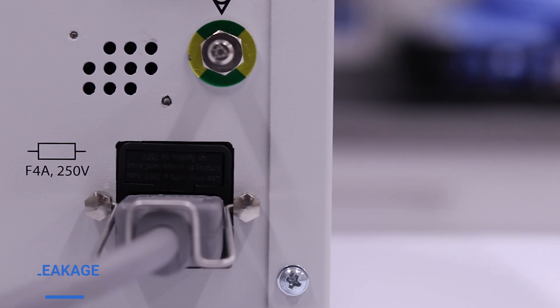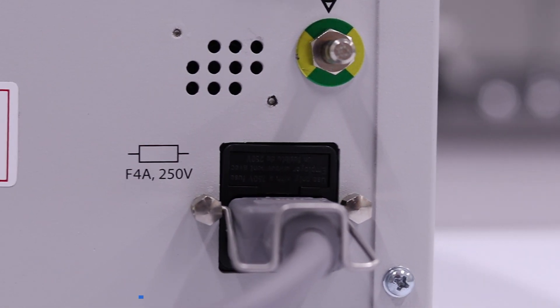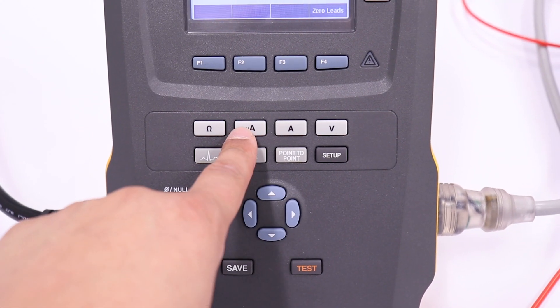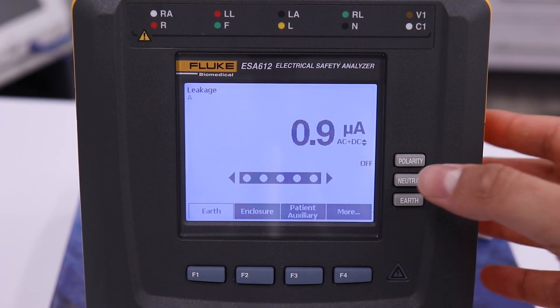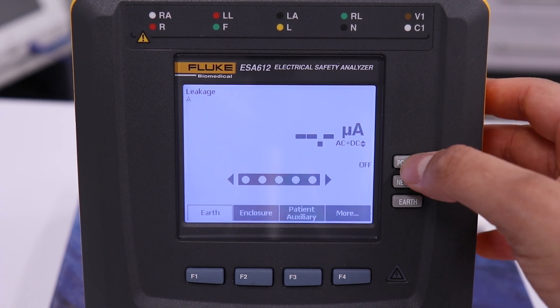The earth leakage test measures the current flowing down the protective earth conductor of the mains inlet lead. To measure earth leakage, press the micro amp button. Cycle through polarity, neutral, and earth settings by pressing the buttons on the side of the screen.